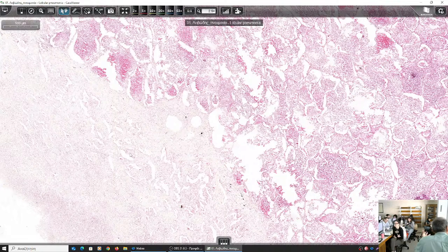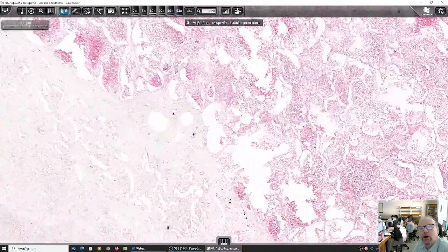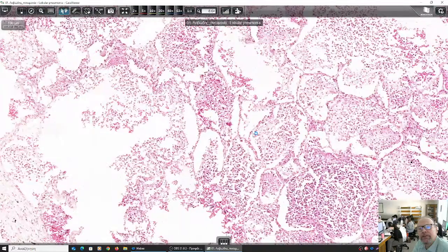So fibrous tissue deposition, scarring, desmoplastic reaction, all these terms are similar and are hallmarks of chronicity. Chronic inflammation has this. And here we have a complication of pneumonia in which a significant part of the lung parenchyma is replaced by fibrous tissue. Okay. And why did all this go wrong in this patient? Let's have a look.